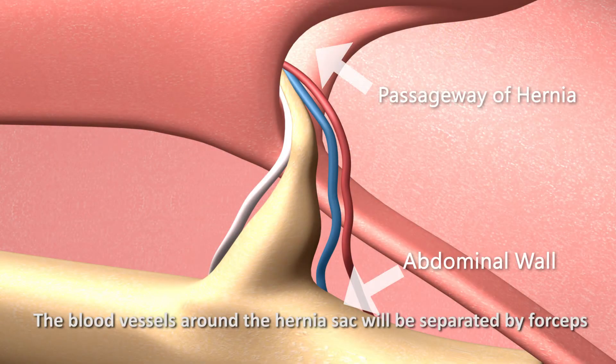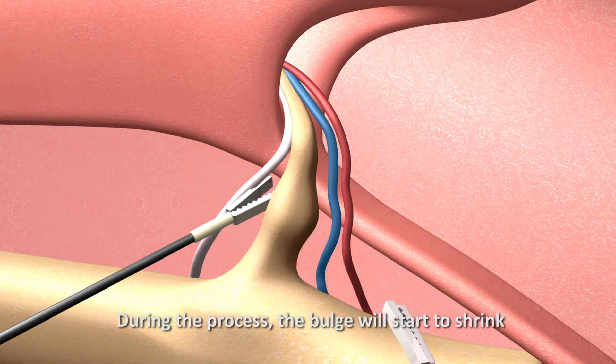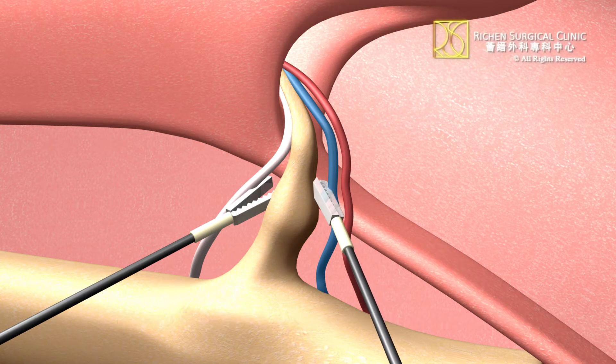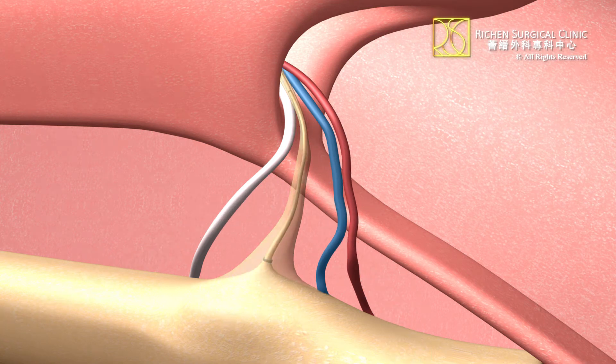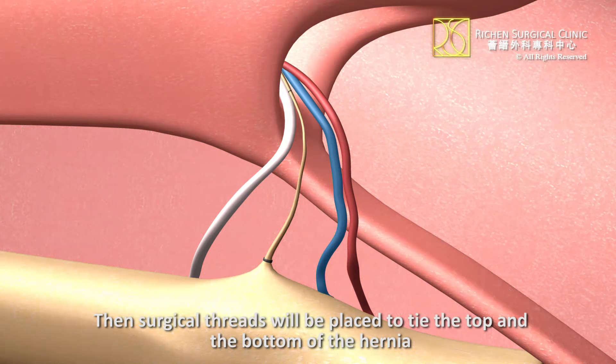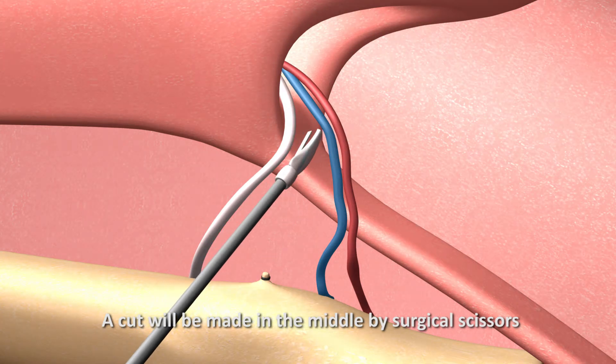The blood vessels around the hernia sac will be separated by forceps. During the process, the bulge will start to shrink. Then surgical threads will be placed to tie the top and the bottom of the hernia, and a cut will be made in the middle by surgical scissors.